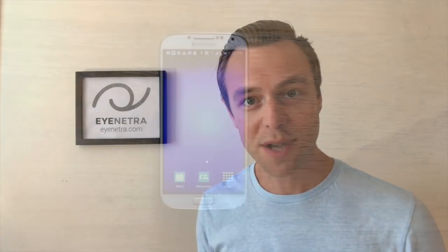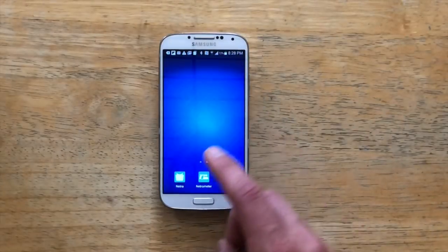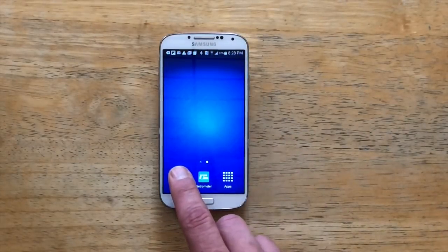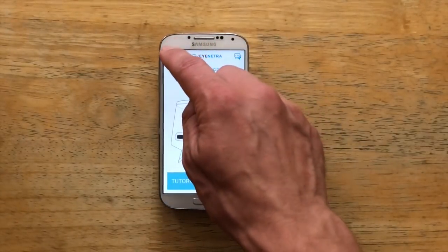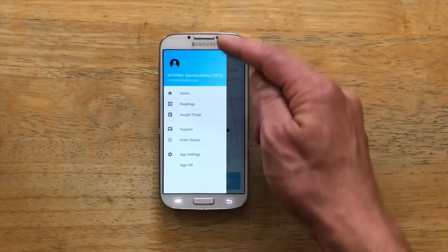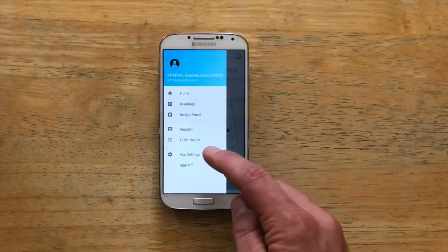Hey guys, Greg here. Today we're going to show you how you can make some adjustments in the app settings to further customize the iNetra test to suit the needs of you and your patients. To access the app settings, we open up the Netra app, select the drop-down menu in the upper left-hand corner, and select App Settings.